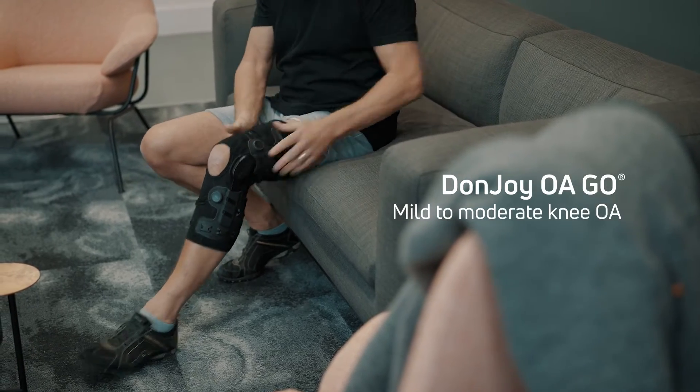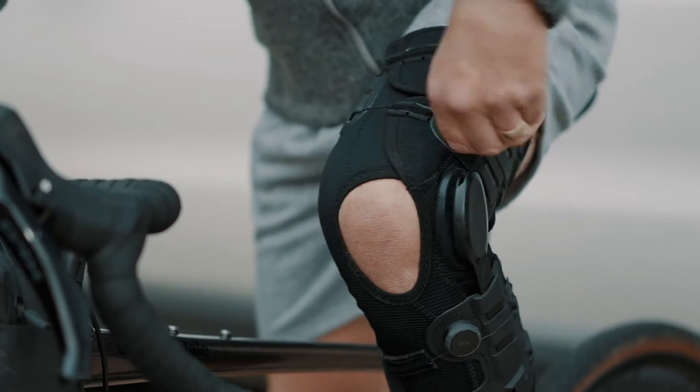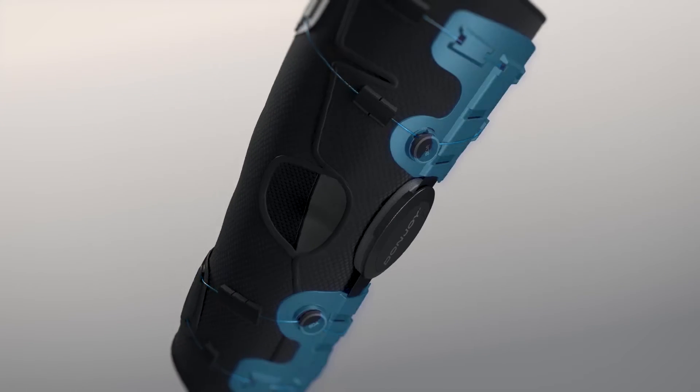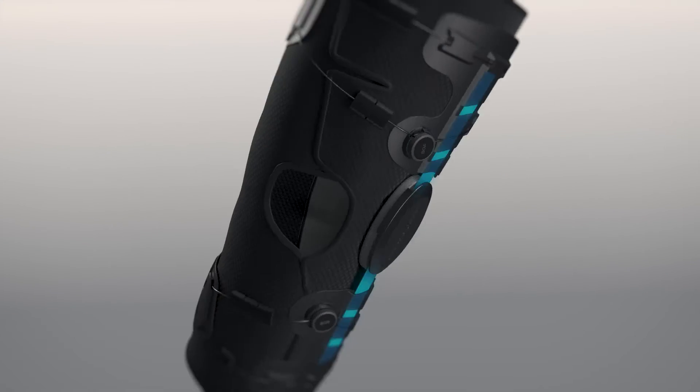Introducing the DonJoy Oago, a unique knee brace designed for treatment of unicompartmental osteoarthritis. Twin BOA dials control two separate loops of cable linked to flexible shells above and below the knee, and a flexible sidebar.